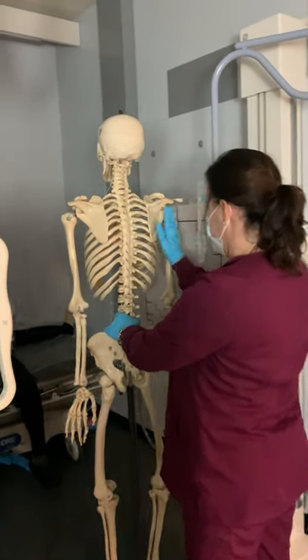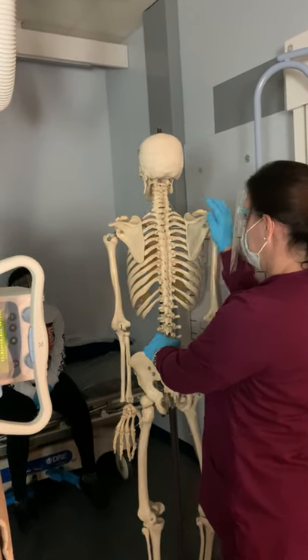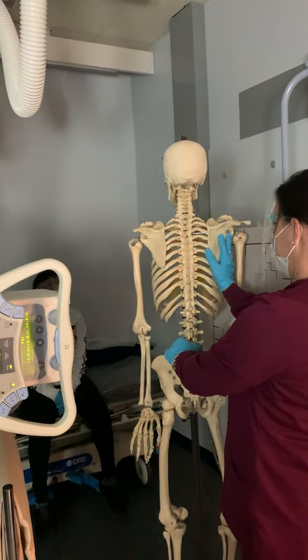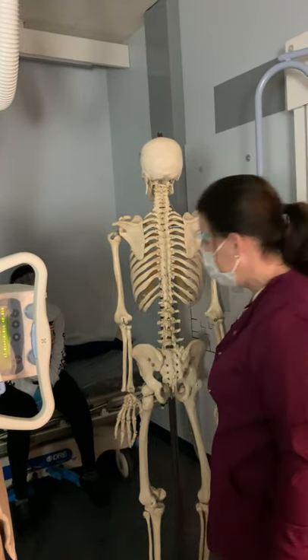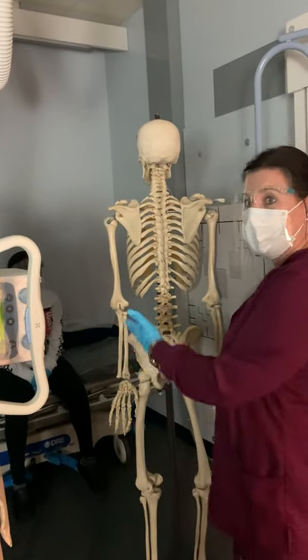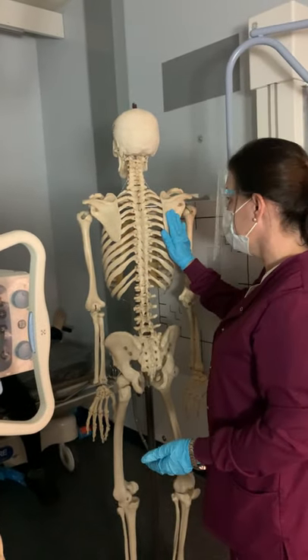What we have to do is get the body of the scapula in a true lateral. That means you're going to have to look at and touch your patient and turn their body. The book says 45 to 60 degree angle of the body — but that's a 15 degree difference. How do you know if you're going 45 or 60? You've got to look at the scapula and make sure you've got the body straight.